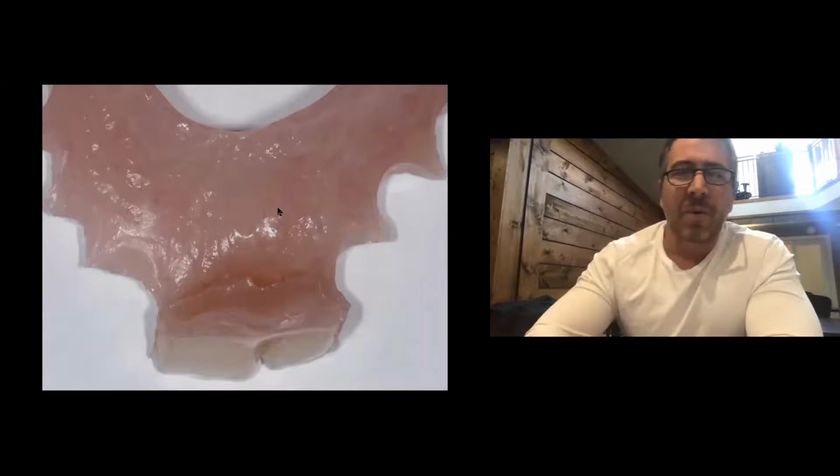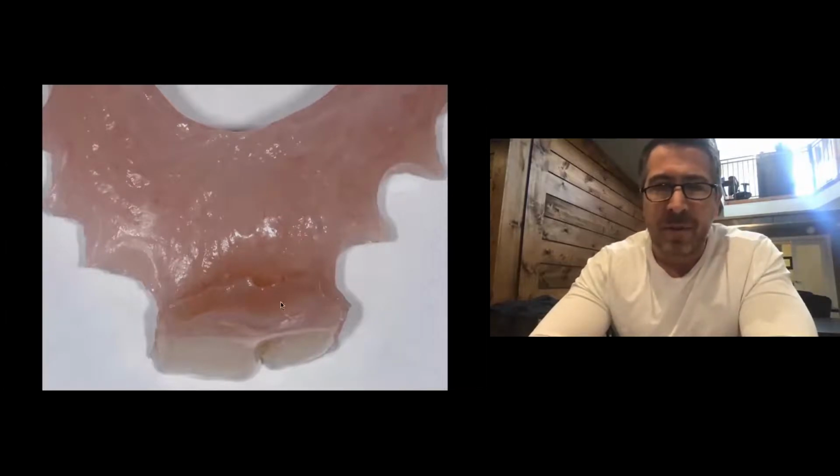She had a consult with another dentist in the city who proposed placing 2 implants with same-day crowns on this lady. If you did that, you know where your zenith is going to end up. It's going to end up way up here and way up here. So I don't know how that was a fair proposition.